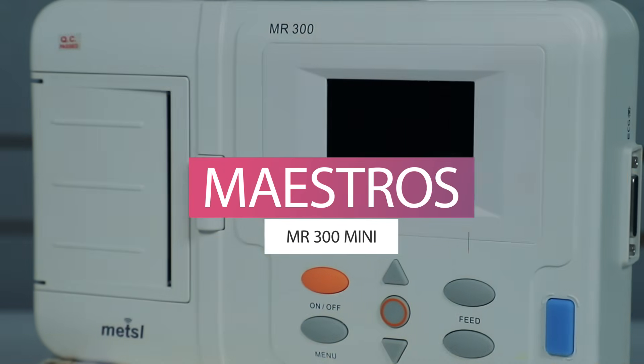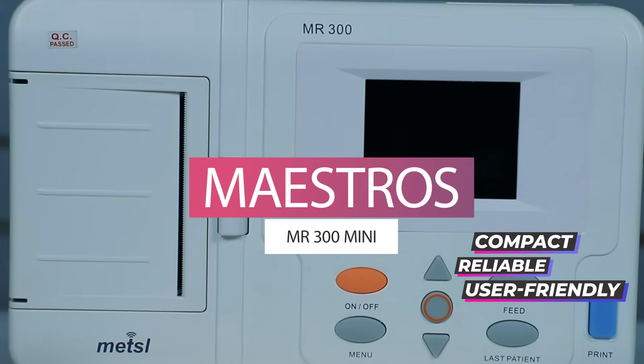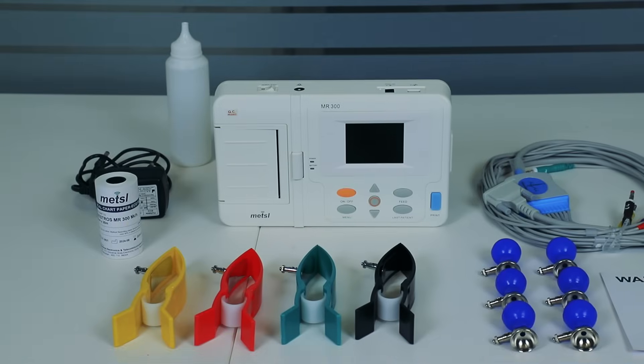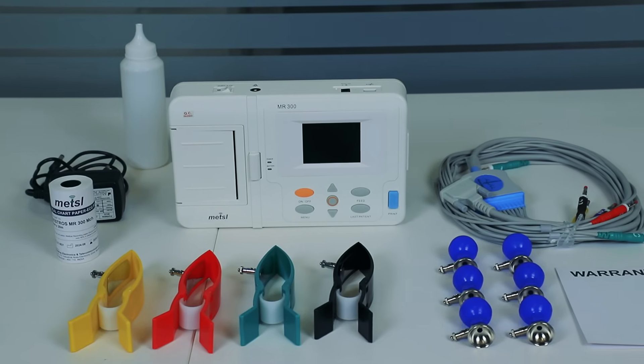Hello and welcome to the product demonstration of the Maestro MR300 Mini Machine — a compact, reliable and user-friendly solution for accurate cardiac diagnostics. Let's begin by unboxing the Maestro MR300 Mini Machine. Inside, you'll discover all the necessary accessories to get started right away.